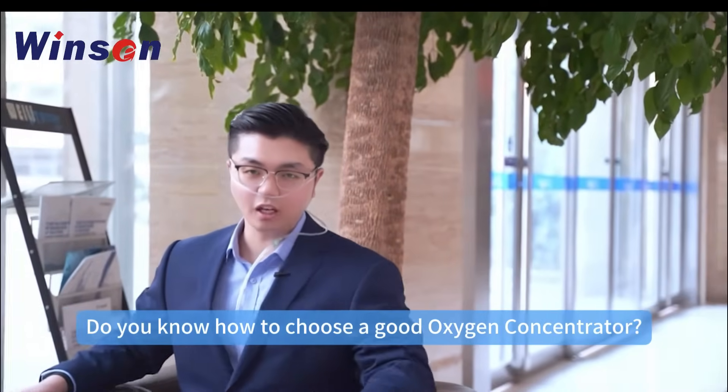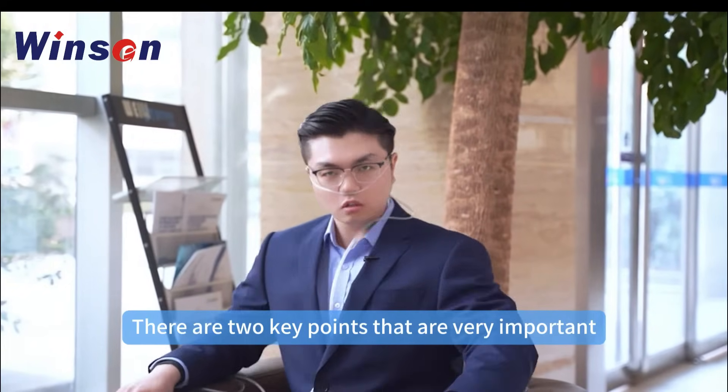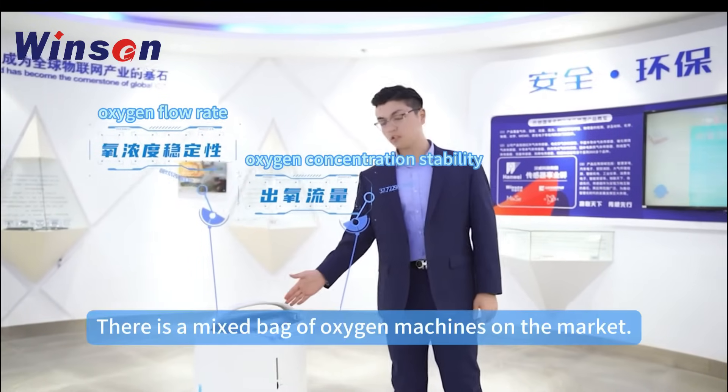Do you know how to choose a good oxygen concentrator? There are two key points that are very important. Winson will help you find out: they are the oxygen flow rate and oxygen concentration stability.